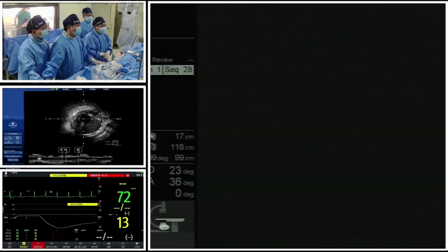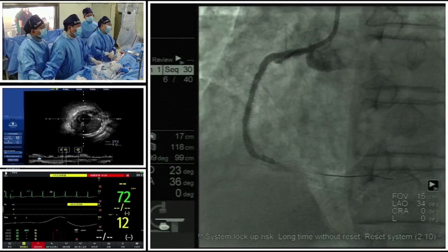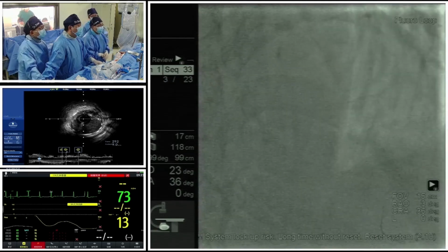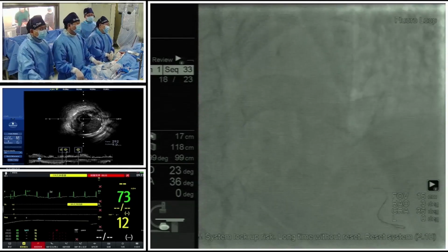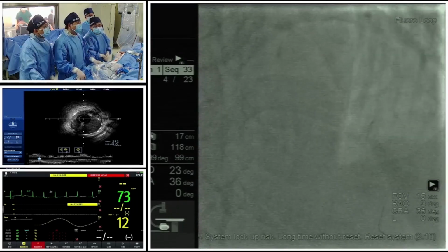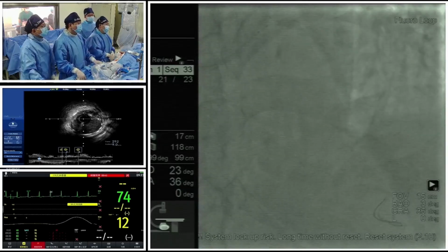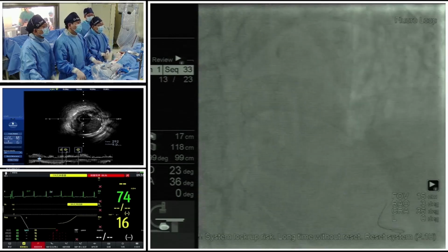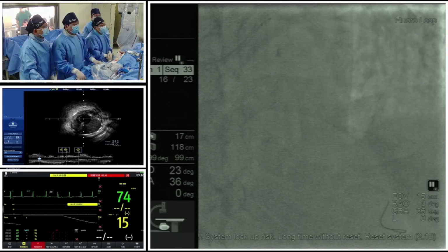In this patient, we used the microcatheter-based FFR technique to re-evaluate the hemodynamic significance of the LAD lesion, and our FFR result showed 0.65. It's in very good agreement, and so the LAD lesion should be treated with PCI because of the significant effect on the hemodynamics.